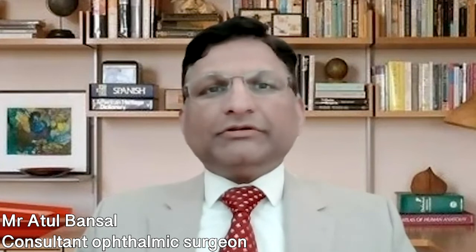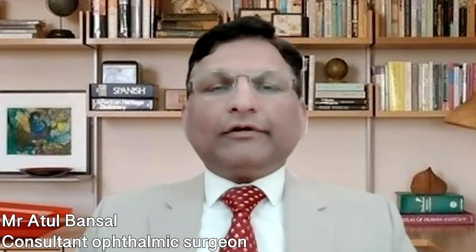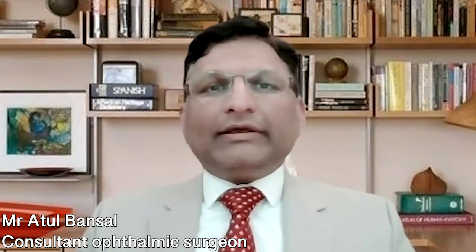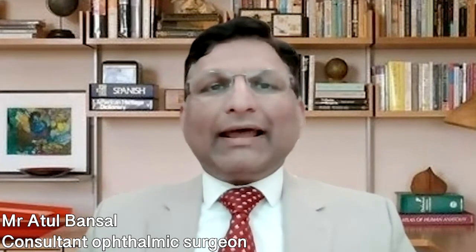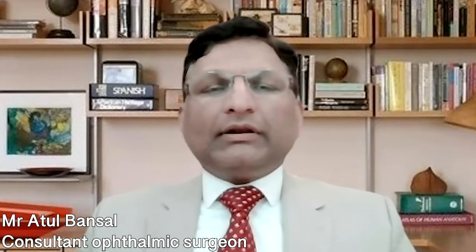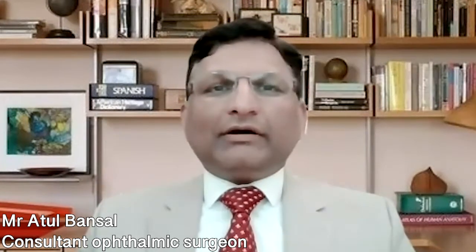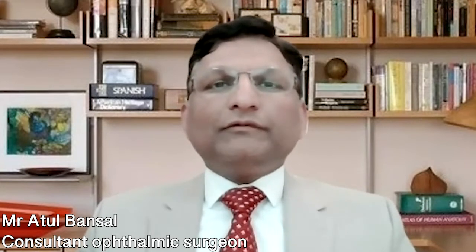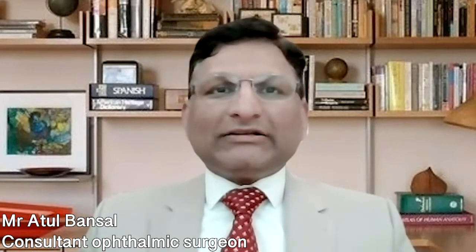The second procedure that I mentioned is YAG laser iridotomy, which is used in cases of narrow angle glaucoma, which is a second category of glaucoma where the drainage channels not only are not working, but the access to drainage channels is restricted because of narrowing of the angle of the eye. In such cases, laser light is focused on a part of the iris to allow a channel to form between the front part of the eye and the back part of the eye, so we can remove the block in the pupil, which leads to suddenly raised pressure or chronically raised pressure.